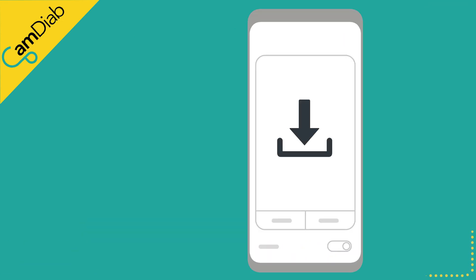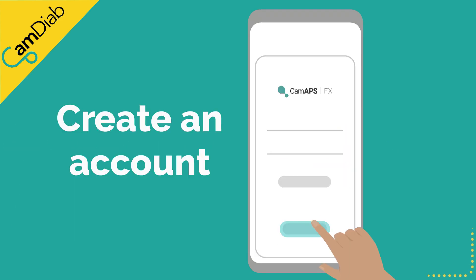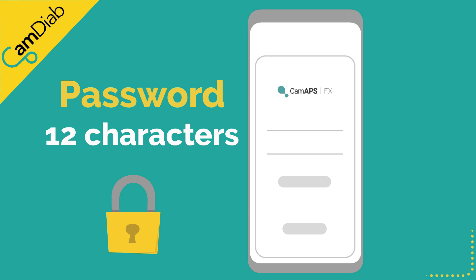Please download the CAM APS FX app from the Amazon App Store onto your compatible Android smartphone. Create an account using your email address and choose a secure password. This password needs to be at least 12 characters long and include at least one capital and lower case letter, number and special character.